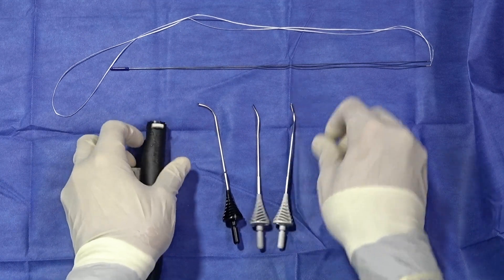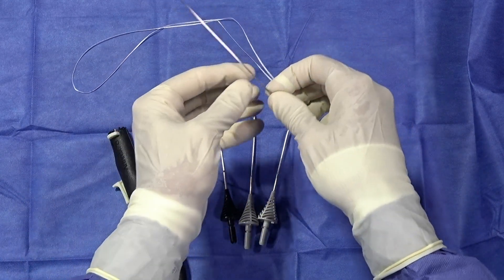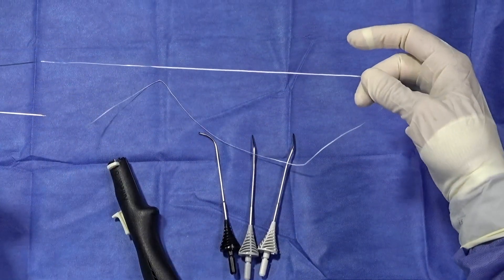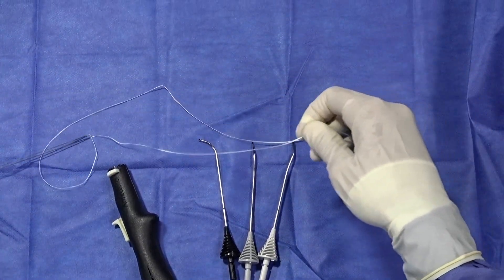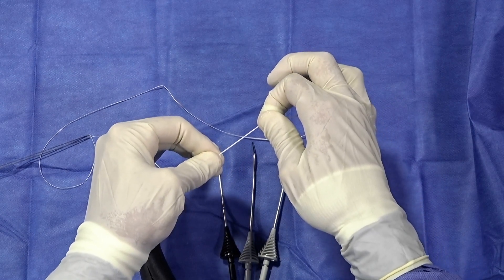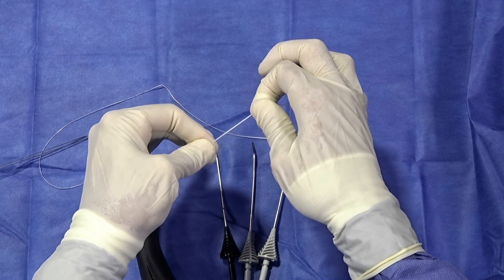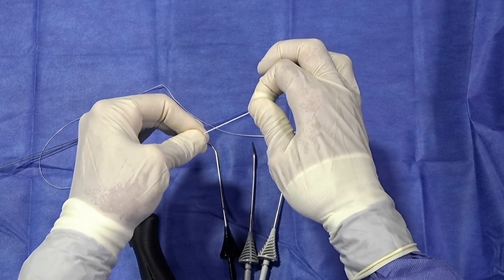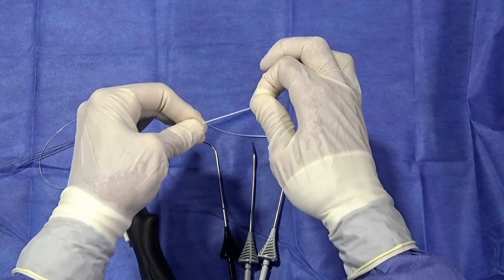The suture concept is also new. This mini suture tape has the typical inside-out needles but also has a 2-0 tape, which will provide better purchase on the meniscus and hopefully splay out some of the forces, allowing us to tension very carefully on the capsule without the need for implants.